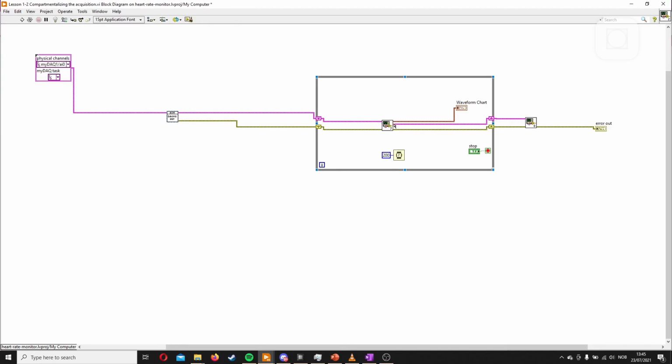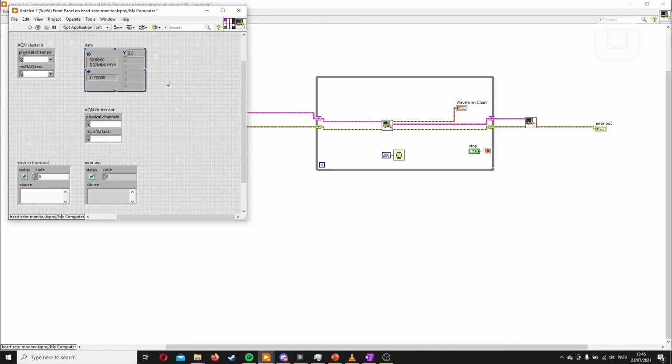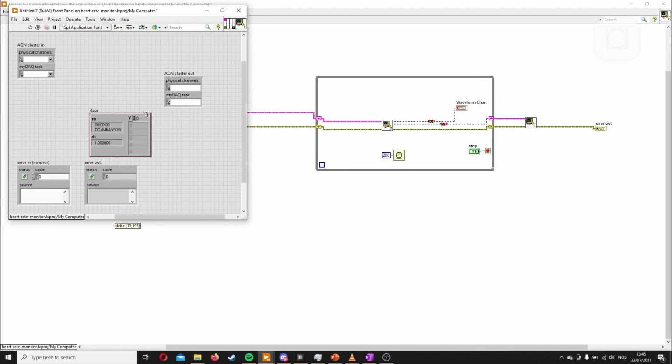And also, before we go into it, we see that the same cluster goes out there, and this is bad practice. You want the same type of cluster to go in and out of the same position on it, not swap like this. So we can start by just swapping this. What we'll do is disconnect this terminal, disconnect this terminal, and then also swap them here to make it match with the pattern. This is good because it just makes it nicer to read later. Making readable code is important. And we'll remap it. Here we go.